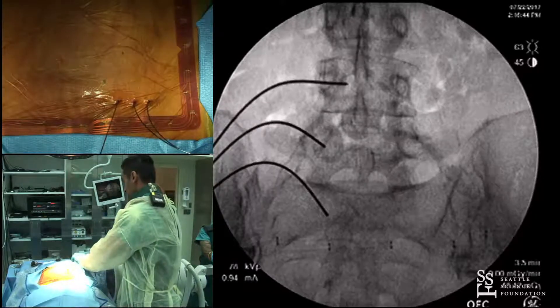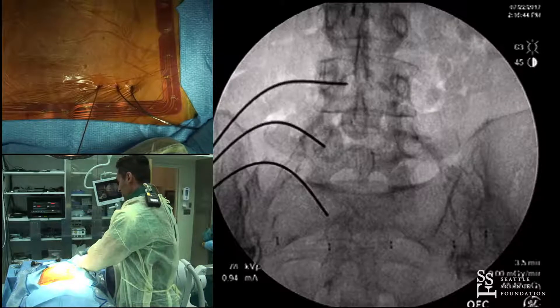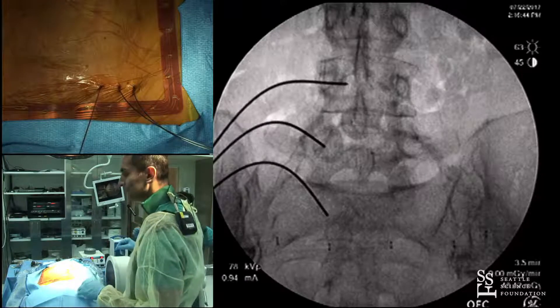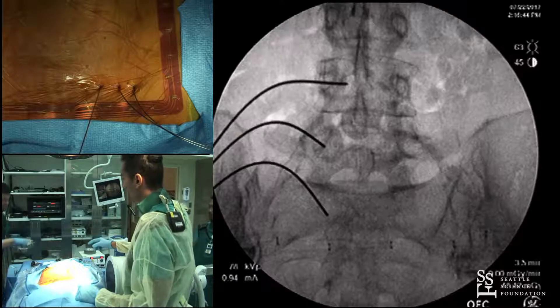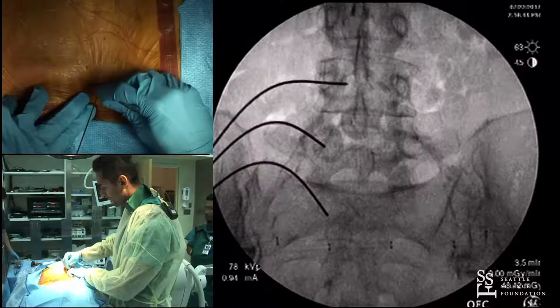You mentioned bicortical fixation — I meant bilateral fixation at the most cranial and caudal levels. I generally don't tap; I pass the screw directly because most screw systems now are conically based and engage very quickly. For bicortical fixation specifically, I only do it at the sacrum — I aim for the tricortical area at the sacral promontory. That's the only time I do it.